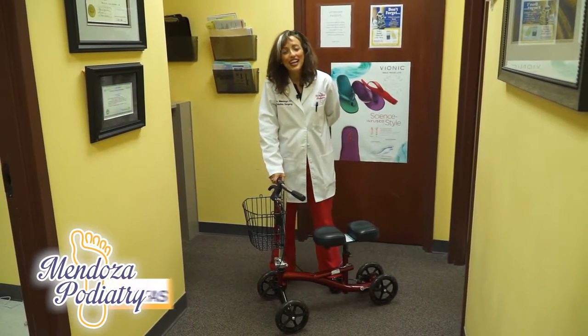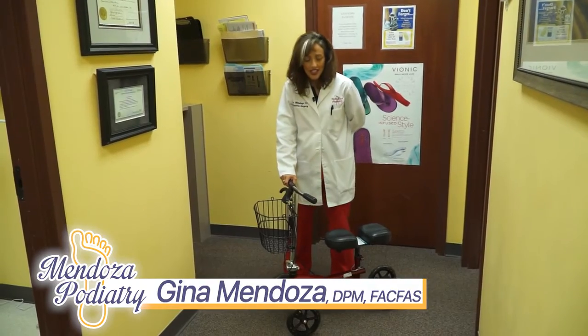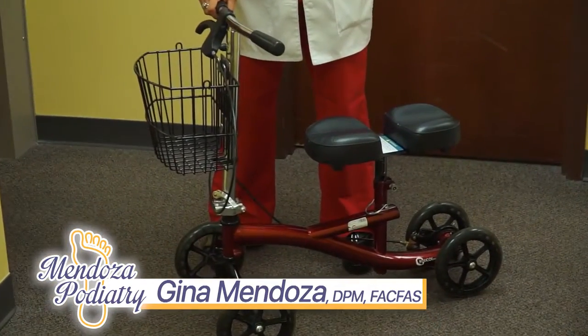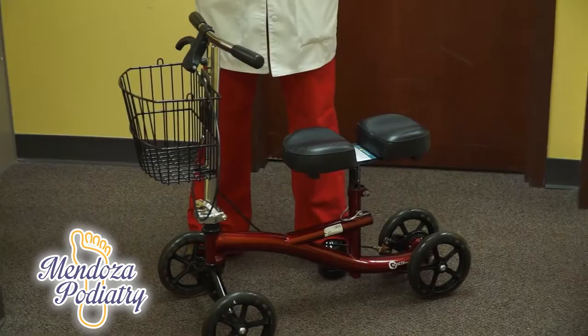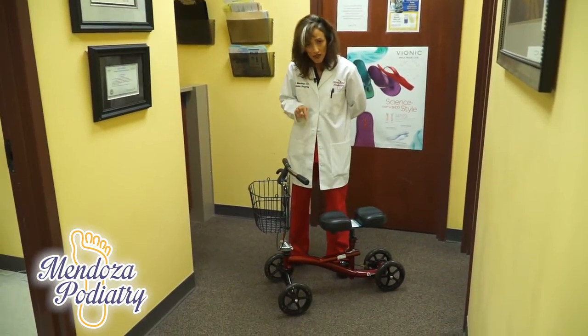Hi, I'm Dr. Gina Mendoza and I'm going to talk to you about a knee roller. This is a great device for patients that have to be off their foot. Maybe you broke your foot and you're in a cast. Maybe you had surgery and you're not supposed to walk for a month or two. This is a perfect device.